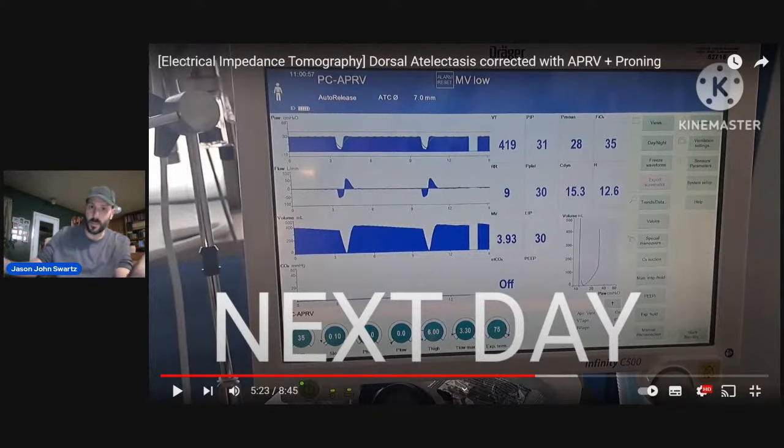So delta P, horrible, not good. If we're going by the drive pressure studies and stuff like that, that's not good. We're increasing ventilator associated mortality with that very high amount.